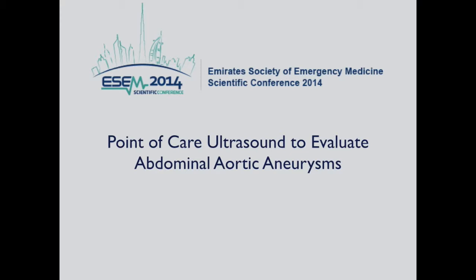My name is Rasha Bohmaid, and in this presentation we will be talking about the use of point-of-care ultrasound to evaluate abdominal aortic aneurysm.